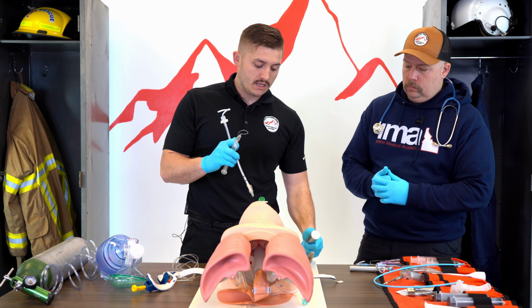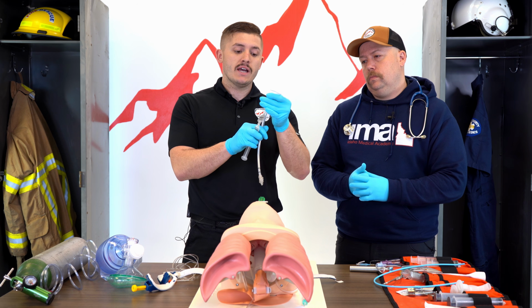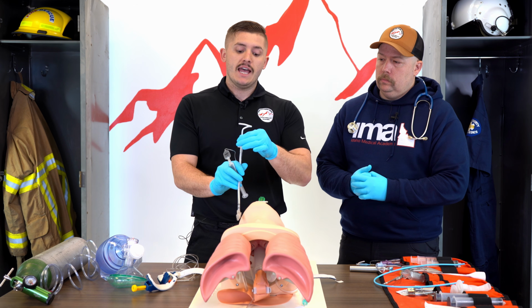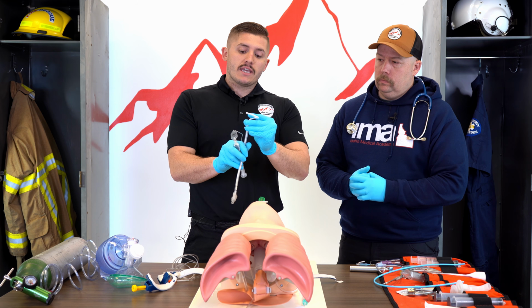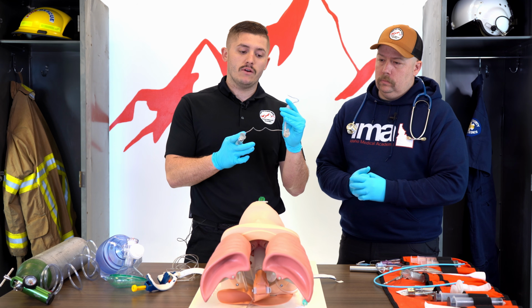As you can see here in the top, we call a stylet. This keeps that tube rigid so it's not flopping around in the airway. Once Chris gets the tube set into the trachea, he might say, Cody, pull the stylet, and I'll be expected to now pull this out. Okay. Again, Chris is then going to inflate this cuff on the bottom, and that is going to keep that tube right in the right place.